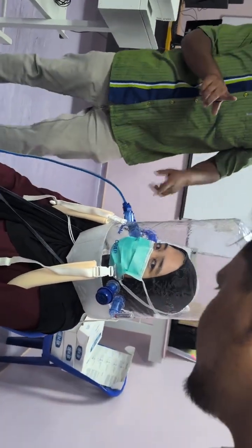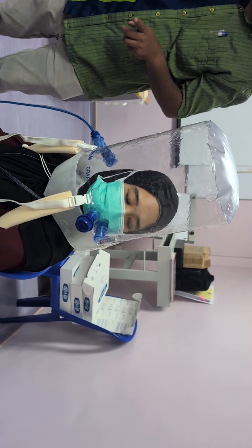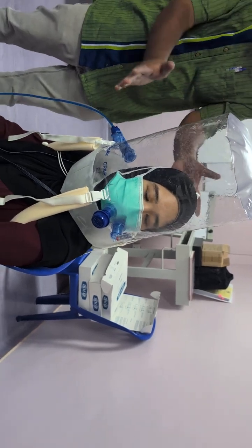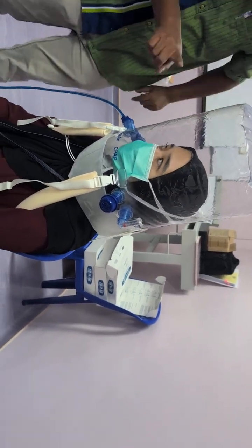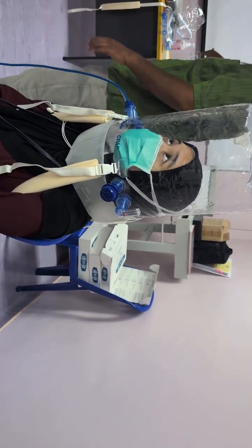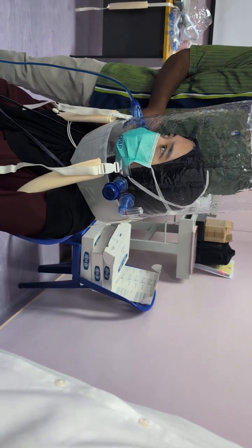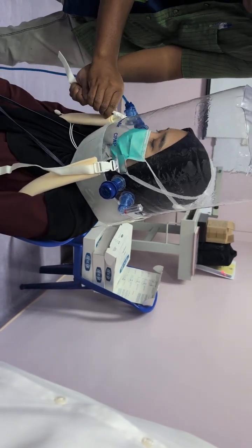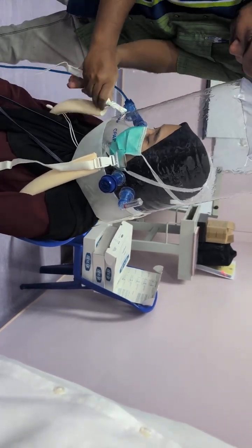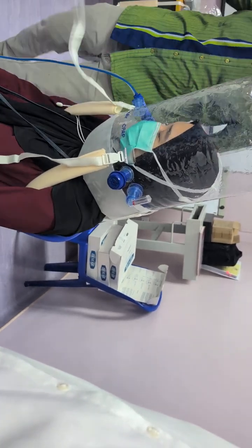Okay, so you see, this is wrong. No, the way of putting it on is correct, it's fully inflated and correct. But you want the patient to be comfortable, right? Including that one, same story. So for this one, don't give it too much balloon. So we pull it. Actually, doctor, can you help me?